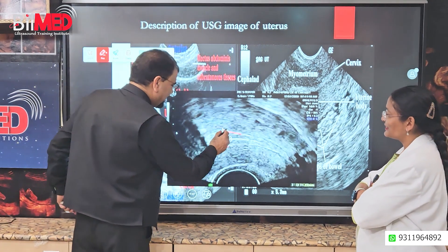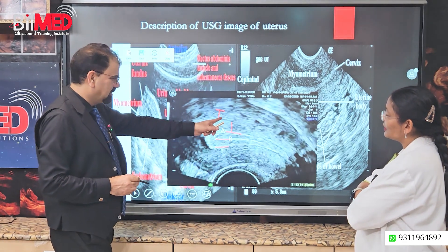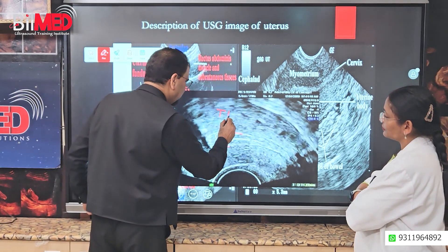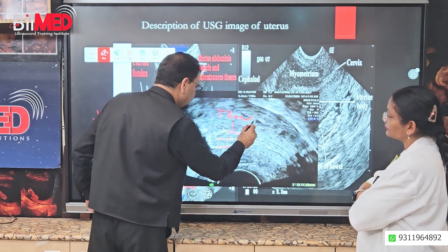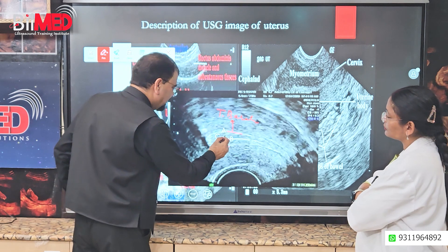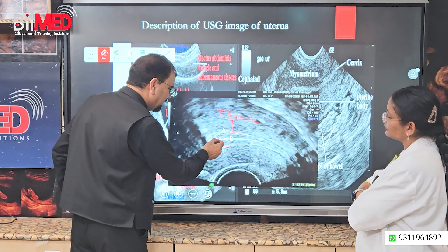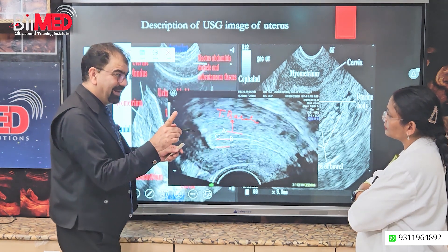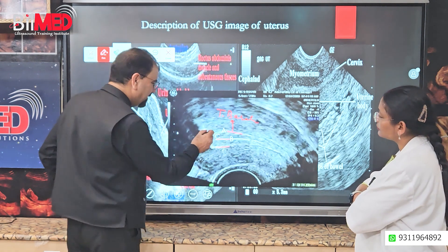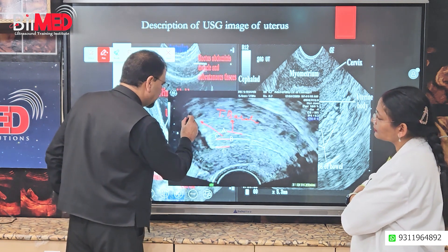Now see — is this tunica functionalis or basalis? This is tunica basalis. So this first layer, A1, is the tunica basalis. And what is this C in between A and B? This C is not actually a line — this is a hypoechoic area in between lines A and B. This C is tunica functionalis.